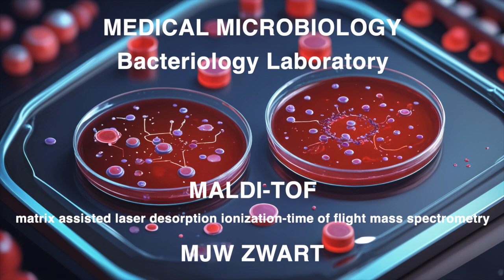The Microflex Work-Wise document mentions this a lot. What exactly is it, and what does it tell us about the instrument's performance? It's like a standardized sample made from E. coli extract, and it contains a specific set of proteins that the Microflex should be able to detect consistently. If the instrument can identify those proteins in the BTS accurately, you know it's calibrated right and ready to analyze patient samples. It's like your daily quality control check. So you run this test before you start your day to make sure it's giving you good results. Exactly. You've got to be sure you can trust what it's telling you.